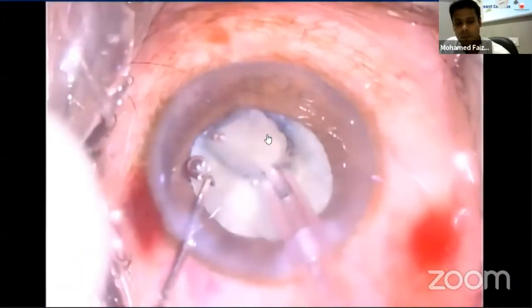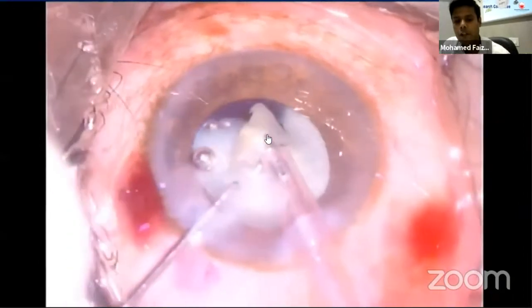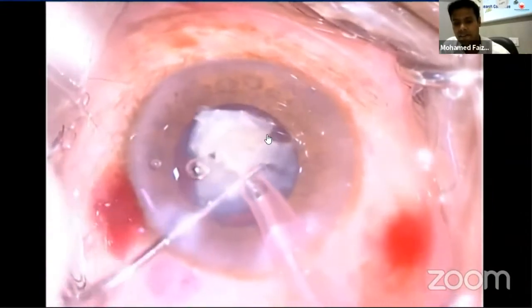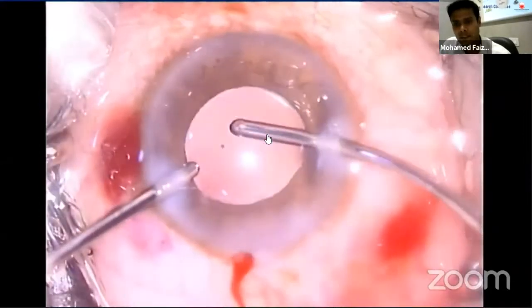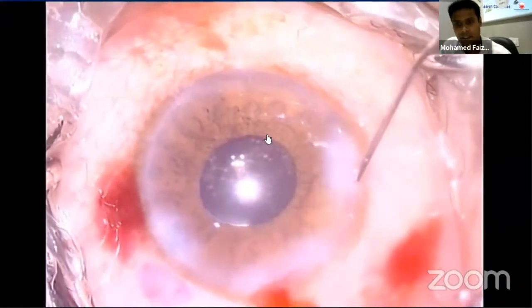Next is quadrant removal. The aspiration rate and vacuum are increased to better draw the nucleus quadrant into the tip. Once the quadrants are in the center they are emulsified and aspirated. In this case, as the pupil was of average size, I didn't go for a pupil expander or retract anything, and the case went very well.